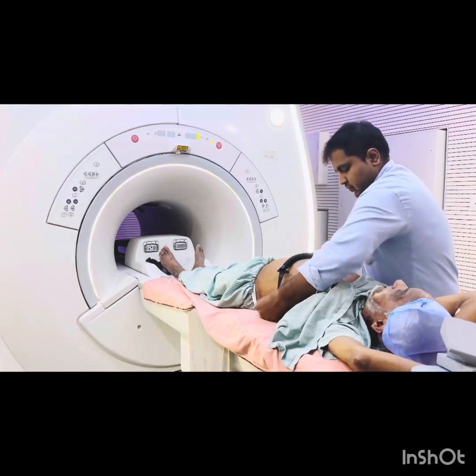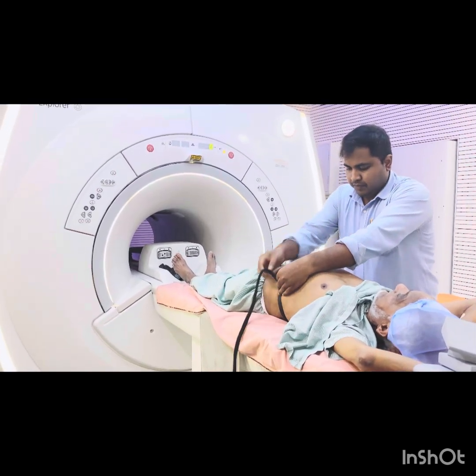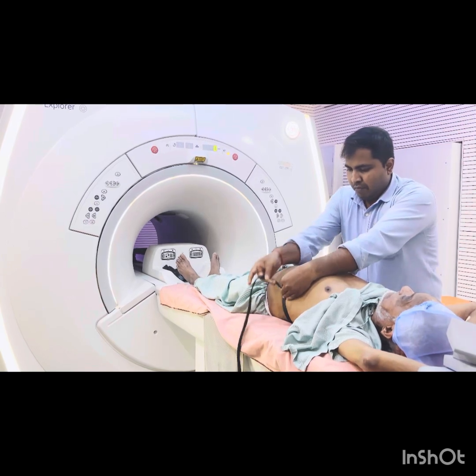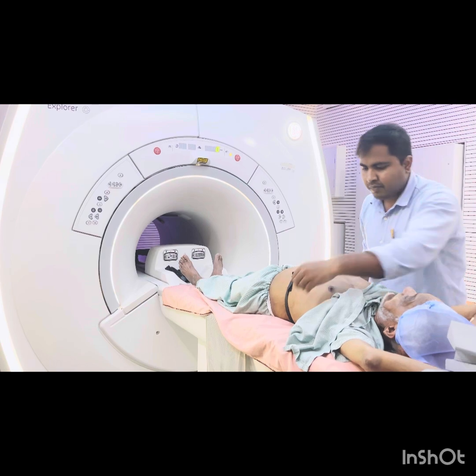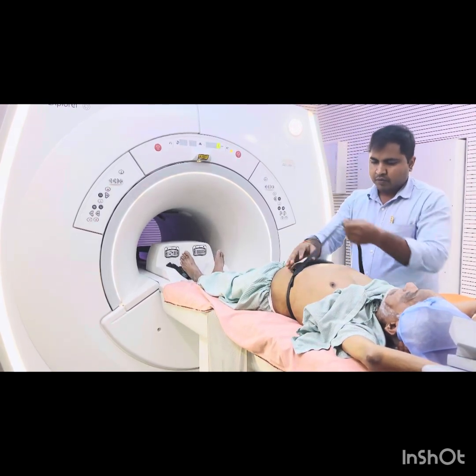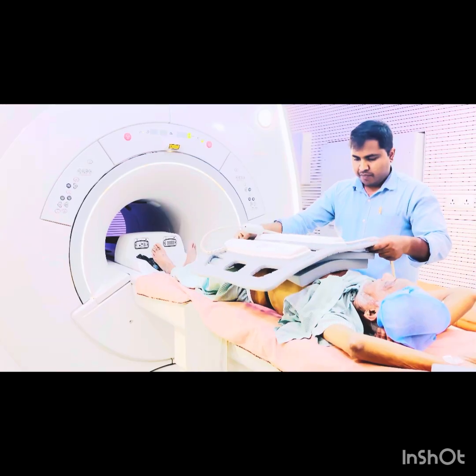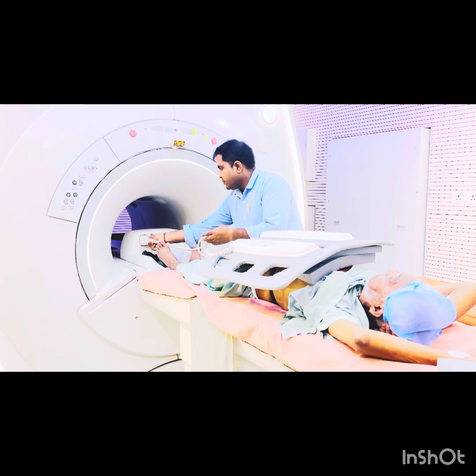Hi, good evening. Today we'll discuss the MRCP. In MRI, MRCP stands for magnetic resonance cholangiopancreatography. It is basically used to visualize the biliary and pancreatic ducts. In this video, we'll explain how to do the patient positioning and the procedure.